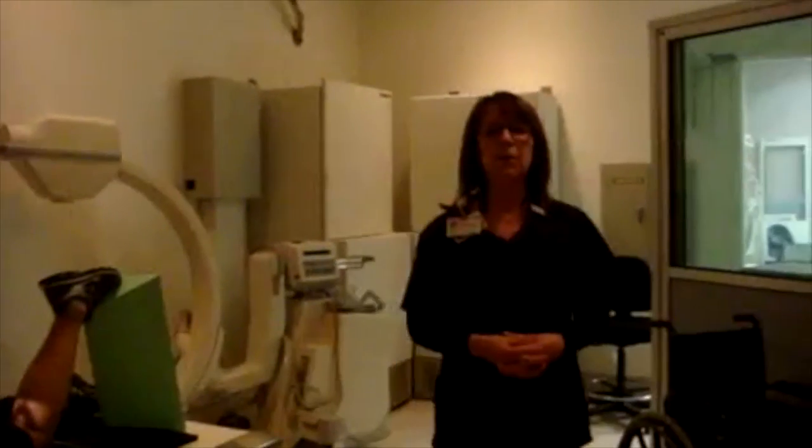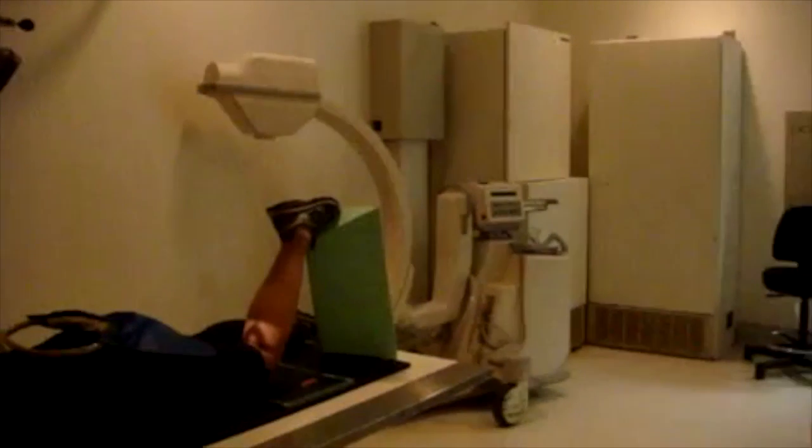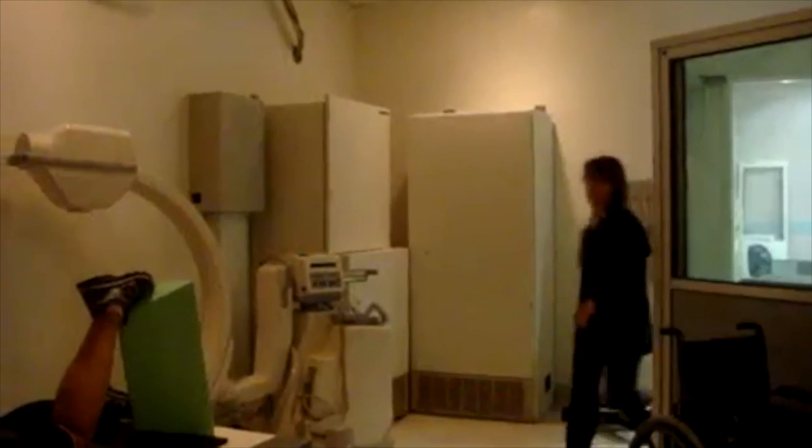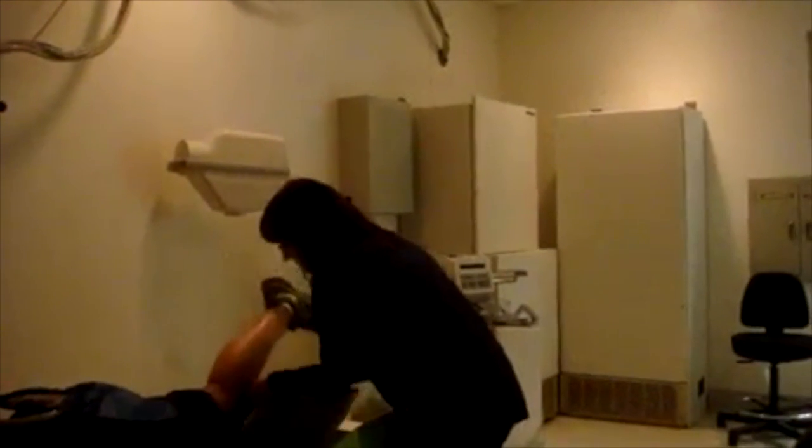You okay? Yes. Let's do it. Okay. All right, so I'm going to collimate as close as I can. That's good. All right, Mrs. DeWitt, I'm going to have you hold still. My technique for my knee is going to be 75 at a 5 mAs. Okay? Hold real still for me. X-ray. Okay. Go ahead and release. Take the IP. Go ahead and lift your knee up for me.